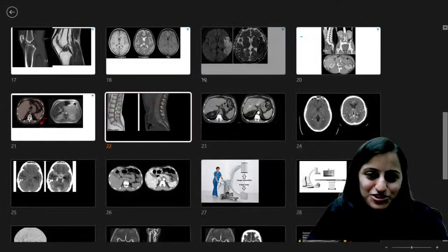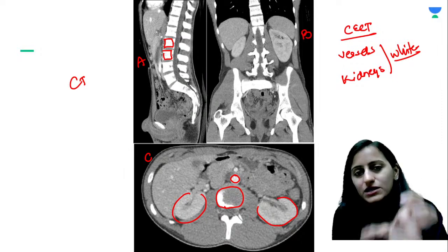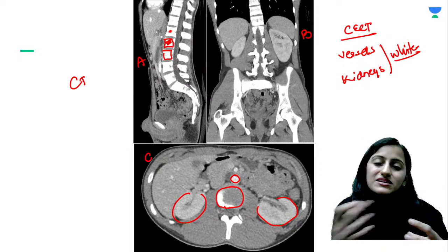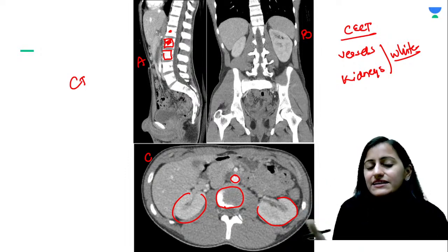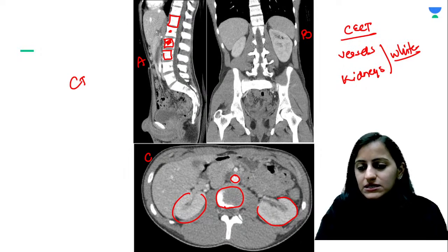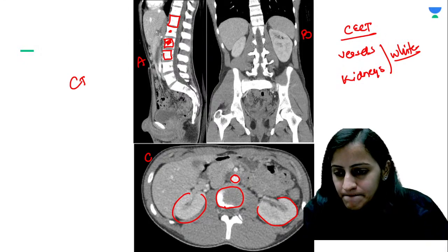हाँ, so no, sir, good question. एक वाला जो मैंने आपको ये इमेज दिखाया था, this one where the vertebra is completely white, right? So how white is the vertebra or how white is the bone? It depends on what is the content of the bone inside. If the bone marrow is fatty with age, the red marrow is replaced by the yellow marrow. It will become darker with age, right? If it's a young patient, a child, जिसमें bone बड़े dense हैं, उसमें आपको vertebra पूरा white दिखेगा. So it depends on the bone density. It is red marrow or it is the yellow marrow.